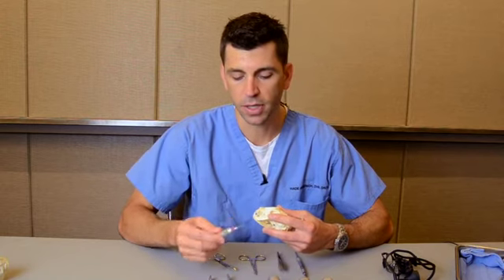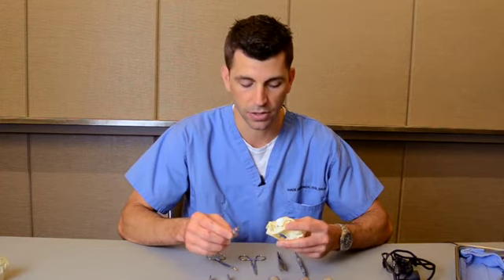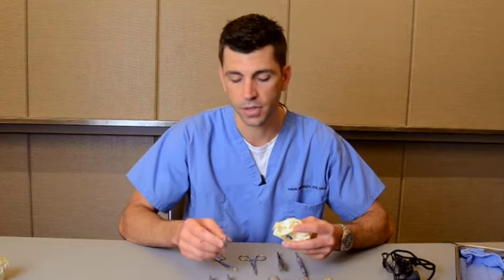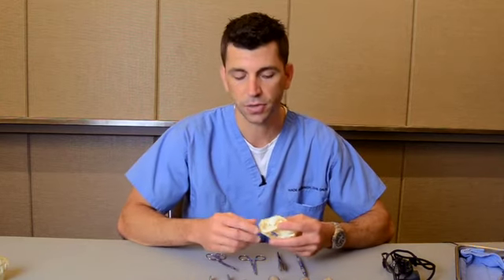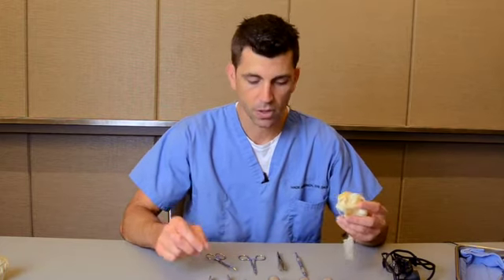But I can tell you again, that this small special feline elevator I will use in 75% to 80% of the feline dental extractions. And it's going to help you in reducing the numbers and frequencies of complications, especially root fracture during extraction procedures. Next, I want to talk about the extraction forceps.